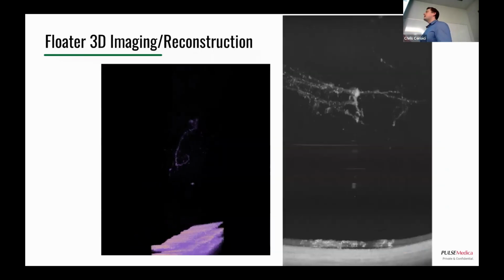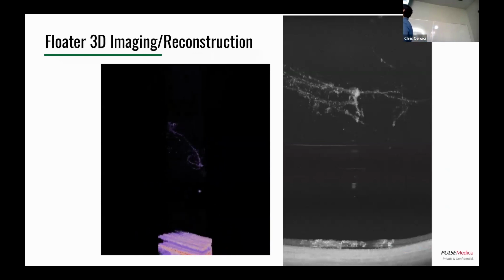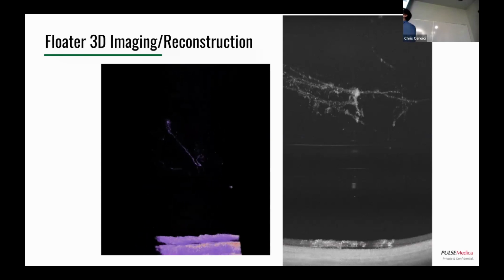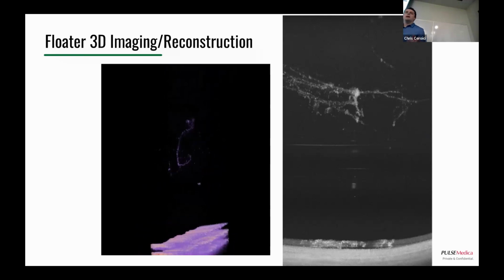Yeah, so that was floater tracking. Another big challenge for us is reconstruction. So I showed you a bunch of floaters. This is kind of a different stringy kind of floater. But there's a fundamental limitation with our OCT, which I had mentioned before, which is our scan speed. If we want to treat floaters accurately, yeah, go ahead.